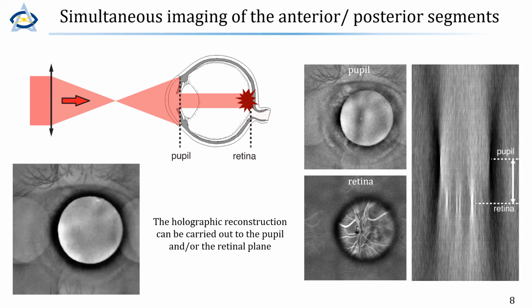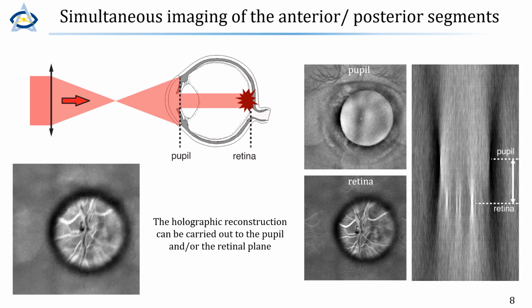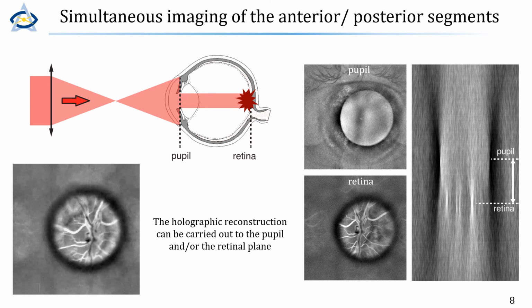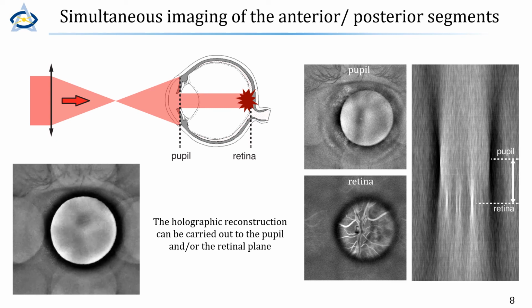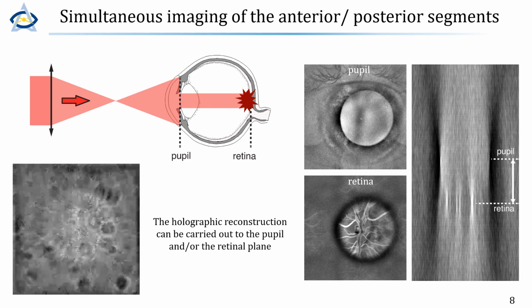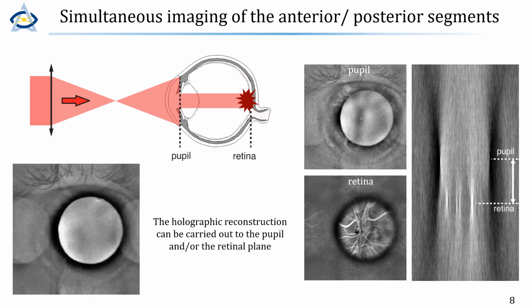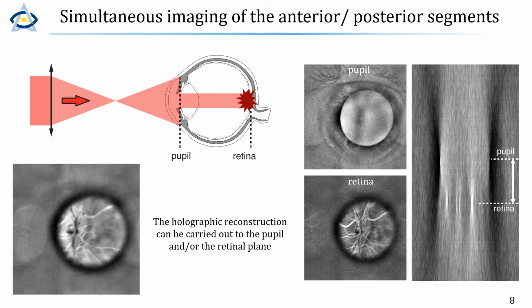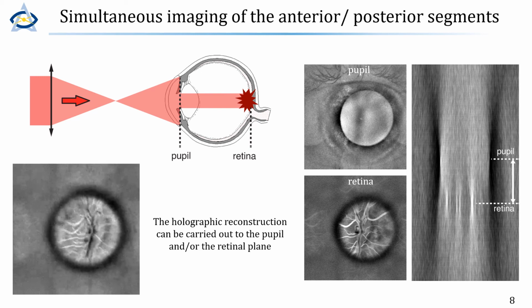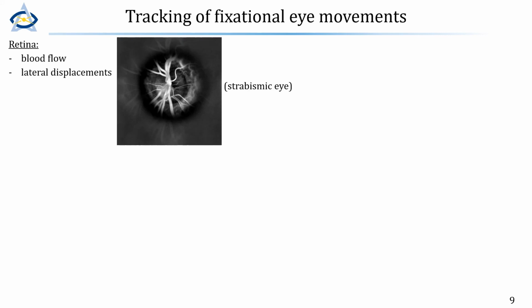So on the top it's closer to the camera, then we can see the pupil plane that we can easily identify in practice, because that's where the contour of the pupil is the sharpest. In the retina, this very bright signal that we see is actually the blood vessel. So there is not a good axial sectioning at all, so I don't know if these images are useful, but what's interesting with this technique is that we have a good temporal resolution. And this can be useful for tracking.